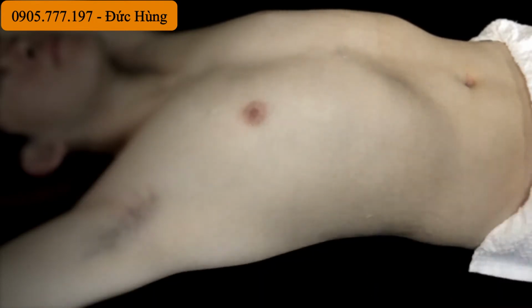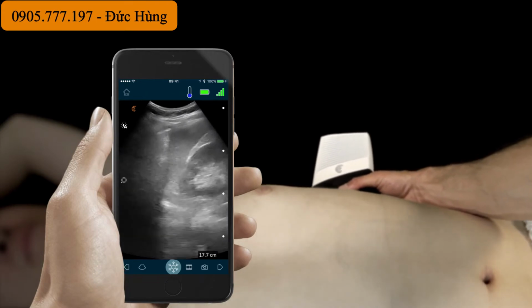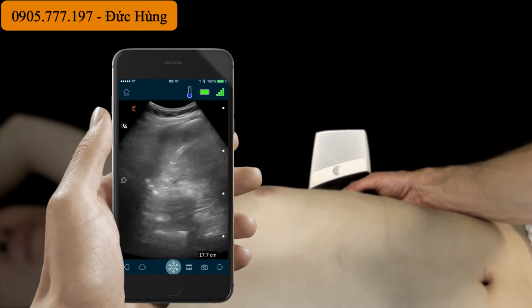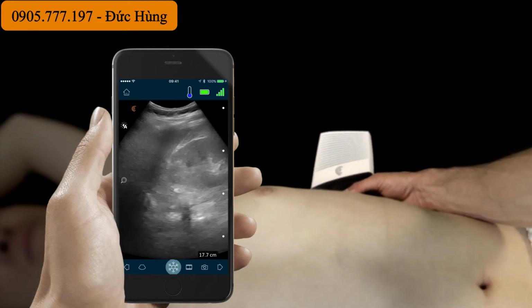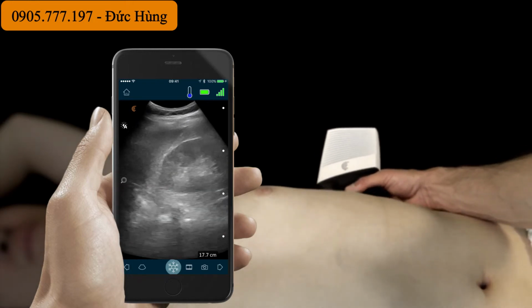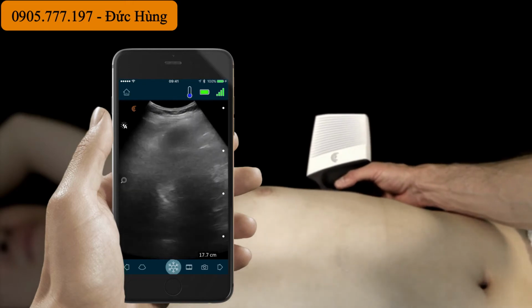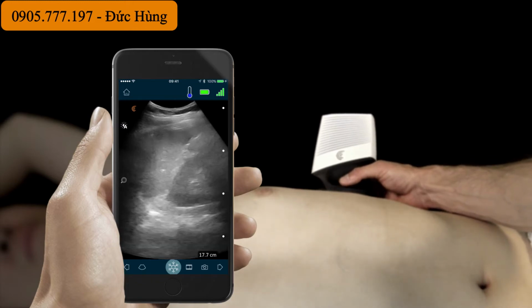For the next part of our fast examination, we're going to examine the left upper quadrant, looking for any sign of free intraperitoneal fluid. We'll use the spleen as our acoustic window to visualize the space between the spleen and the left kidney. We want to make sure that we can see the inferior tip of the spleen as well. And finally, we want to make sure that we can see the interface between the spleen and the diaphragm from 6 to 9 o'clock.